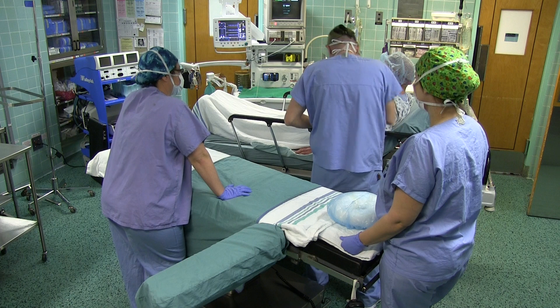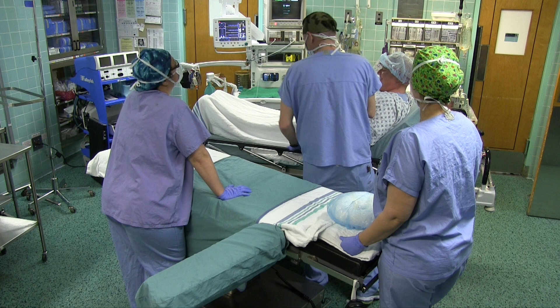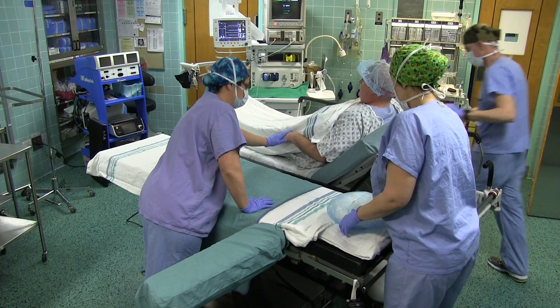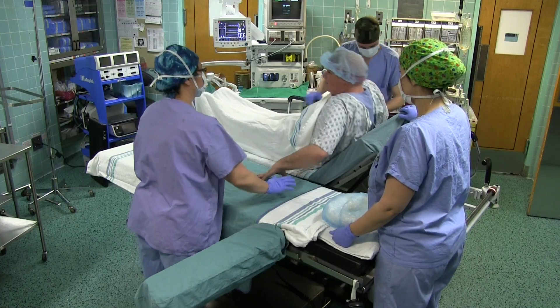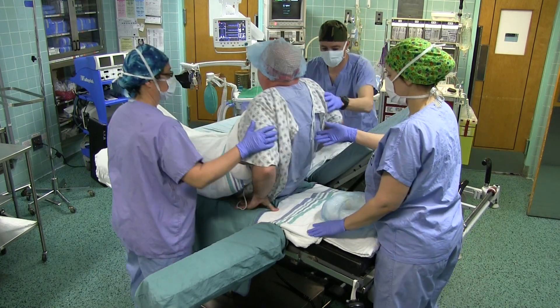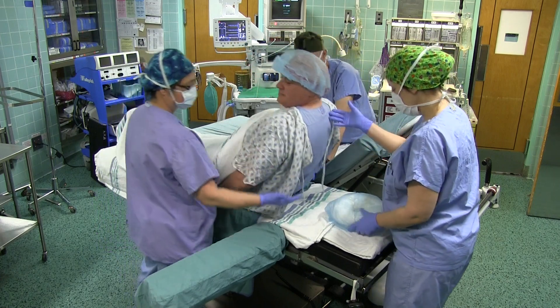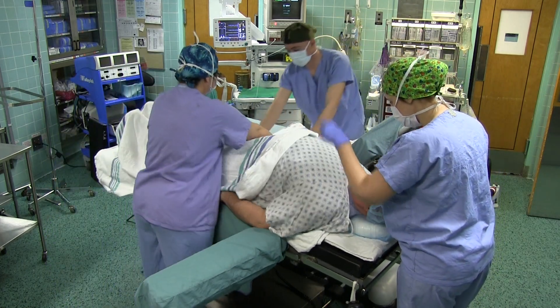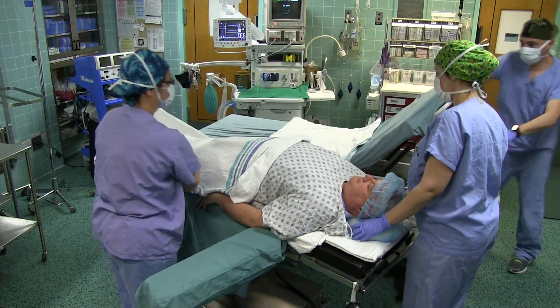Transferring a mobile patient to the OR bed. In order to safely perform the transfer, three people will be required. The orderly will bring the stretcher parallel to the OR bed and lock it into place. The anesthesia team is always at the head and ensures that the OR bed is locked. The patient can then proceed to transferring from the stretcher to the OR bed with guidance from the team. The safety belt is applied once the transfer is completed.